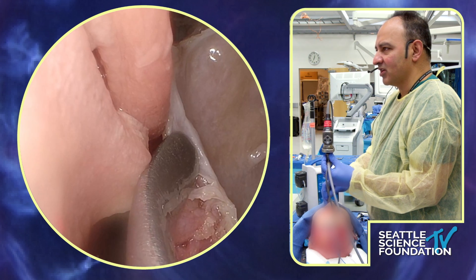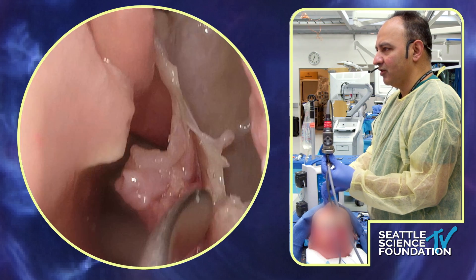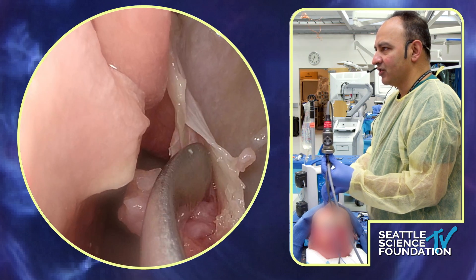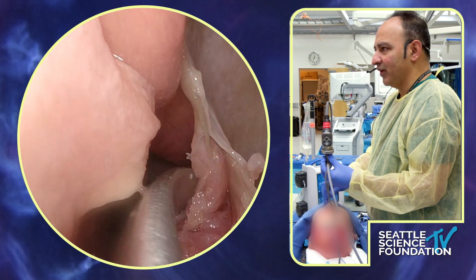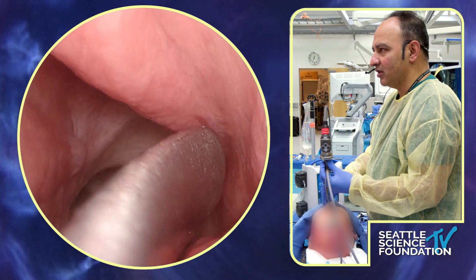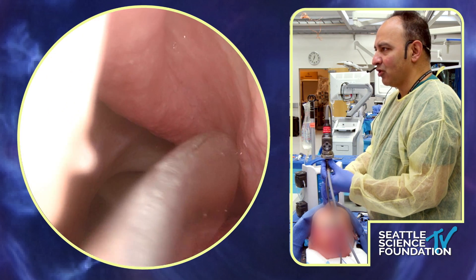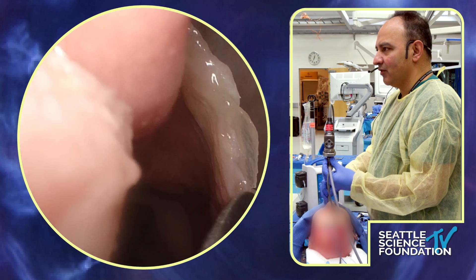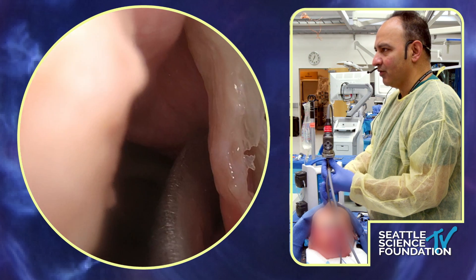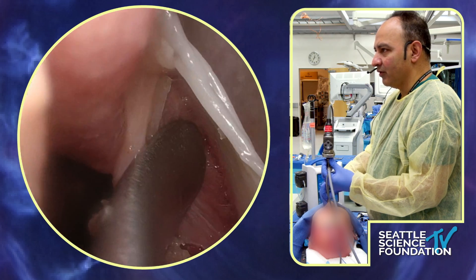Now we have our medial aspect of the maxillary sinus. We're going to start teasing the mucosa off of that — there's a nice plane here that you can develop. We're lucky because the inferior turbinate is missing, so we'll push that back and create that plane. My landmark here is the stump of the middle turbinate right here. The exit of the sphenopalatine artery tends to be right in this area, and there's often a little crista, a little bony prominence, that hides it. Let's see if that's the case here as we start working this flap backwards.